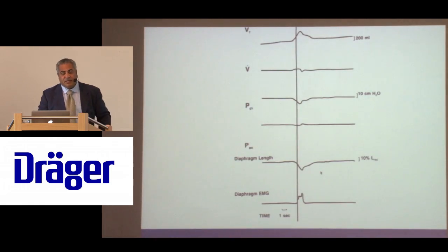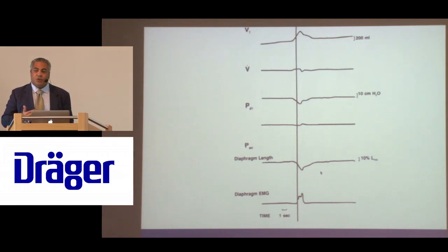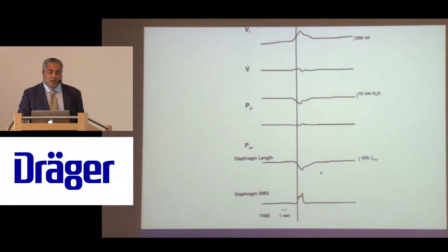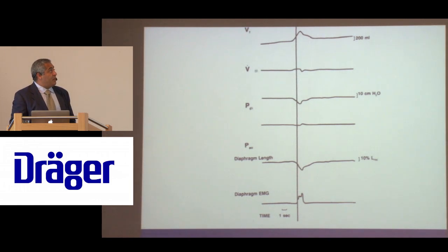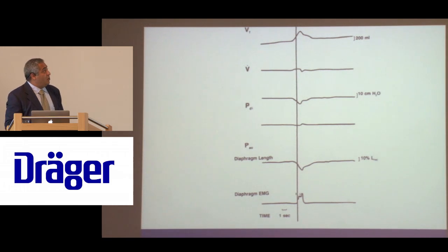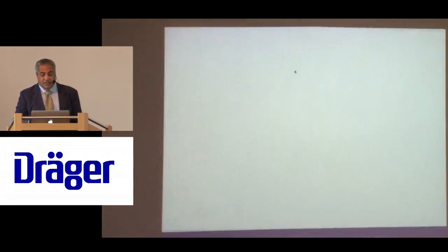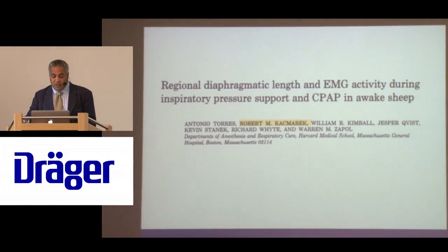And to some extent, I mentioned that there's going to be an assisted portion of the breath. In other words, it has nothing to do with muscular activity. And if you look at tidal volume up here, you look at flow, here's the pressure in the diaphragm, here's the EMG of the diaphragm. So before we actually have an electrical signal, the diaphragm is actually contracting. You have tidal volume and flow. And again, this is from the expiratory assistance, resulting in an inspiratory effort.